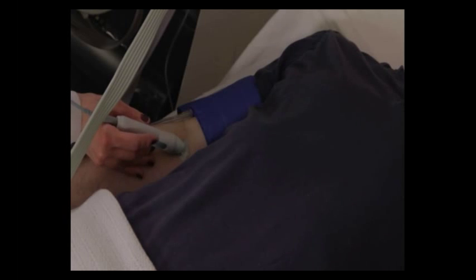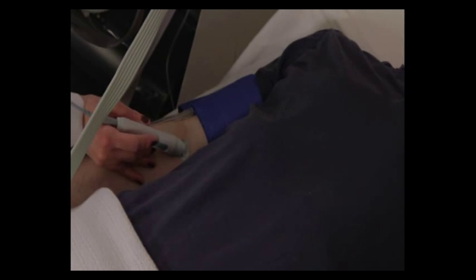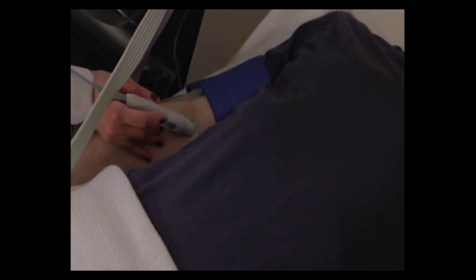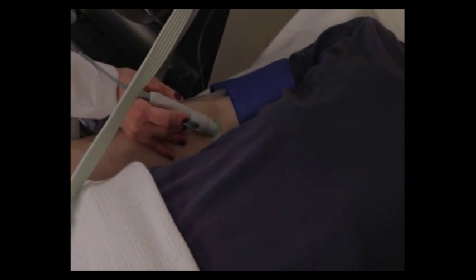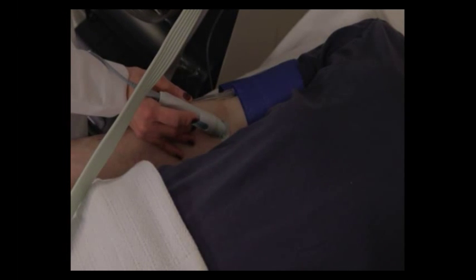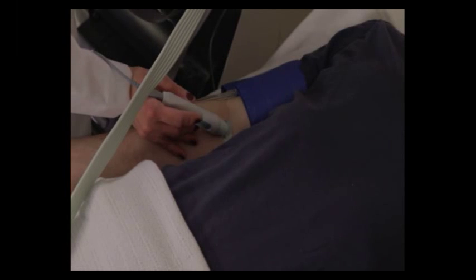We are now going to take our Doppler probe. If you have a patient present that's very heavy set, consider using the 5 megahertz probe, which is also supplied with your multi-lab system. Making sure your probe is at a 45-degree angle to the skin, and then slowly move the probe to the right toward the patient's body.